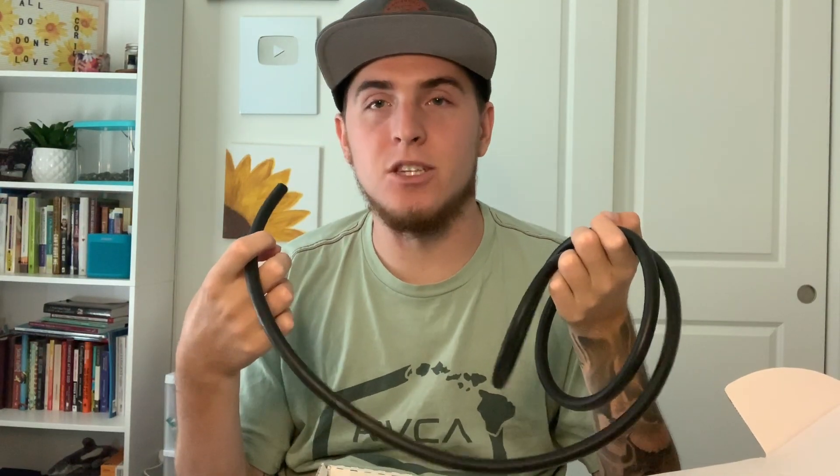It also comes with a bunch of tubing and you can cut however much you need — it'll probably vary for each person. This is actual special tubing that the company sends with it, specifically designed for the Freedom Flow. So if you happen to buy extra tubing for this, you actually need the kind that the company sends you. Again, this is the actual device — it says Freedom Flow on here.